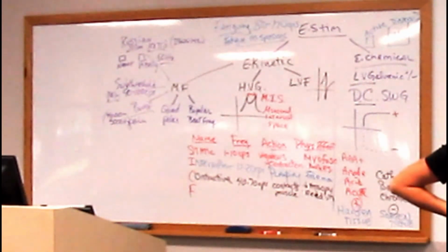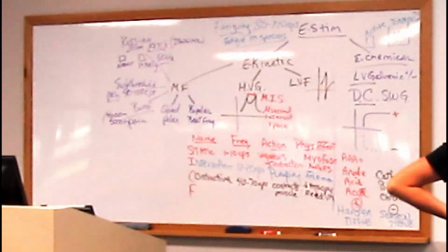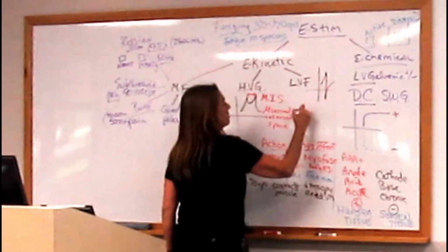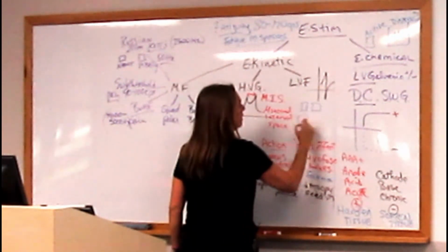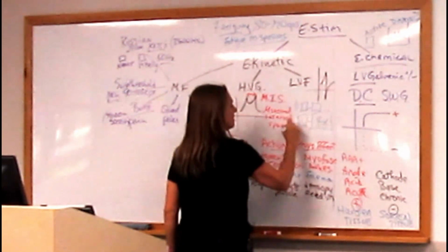And this will be a different type of dispersion. It'll be dispersion of contraction. You won't get a big contraction over here if you use a big dispersive pad. So pad size can be, for these 2 pads or a little pad and a big pad. So these are your 2 choices.